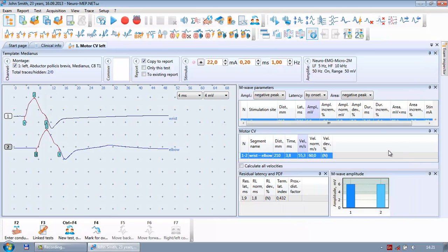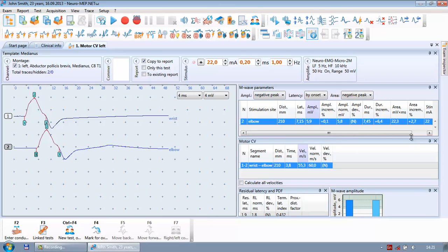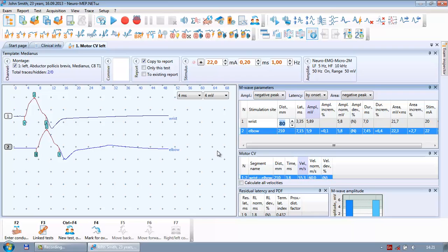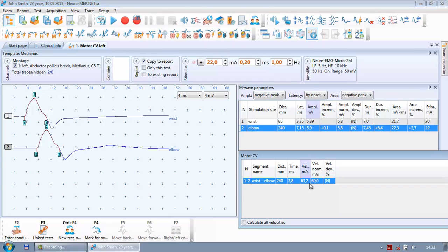Now with two curves it is time to enter distances. I press F2 and the software is ready to accept the first distance — measured between the recording electrode and the stimulating electrode, between the minus contacts. For this patient it is 85 mm. I press F2 a second time and the software is ready for the second distance, which for this patient is 240 mm. The software then automatically calculates the conduction velocity, which is 63 m/s — slightly above normal, meaning velocity is okay for the medianus of this patient.